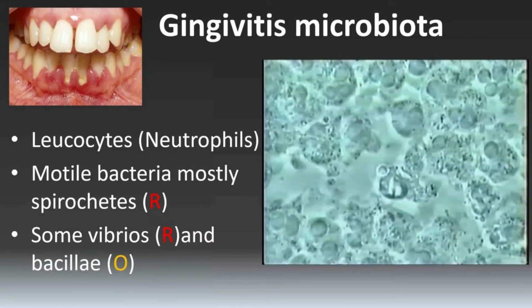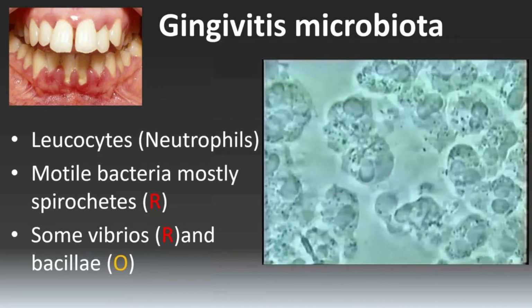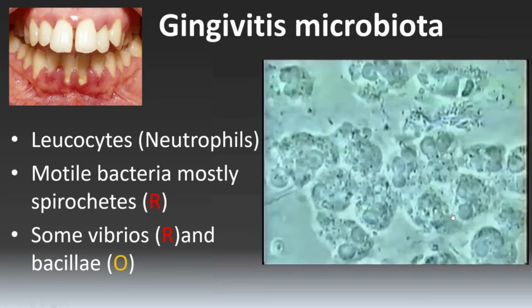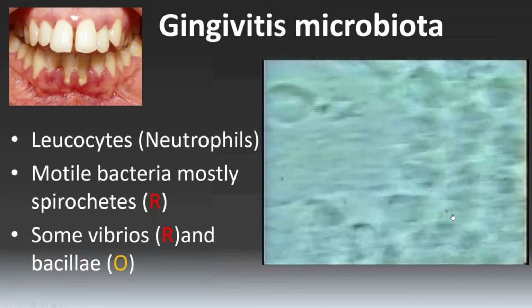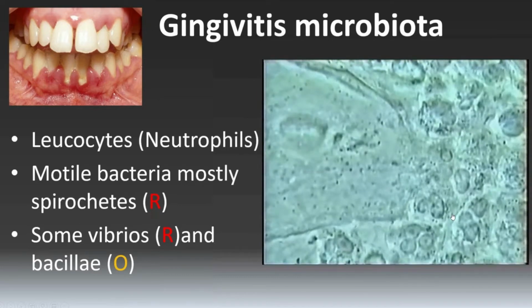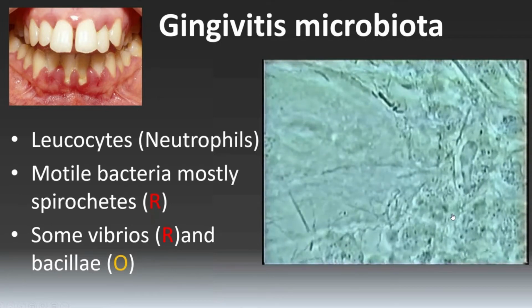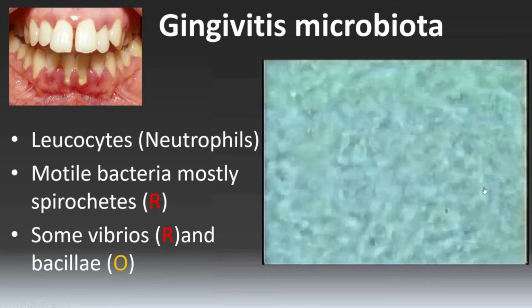So let's see again gingivitis. What is gingivitis? Here on the film with the patient, what do we see? This big gingivitis. See how big it is? You know, big gingiva, the gum line is like this. We look at the case, we think it's periodontal disease. It's not. There's no pocket higher than 4, no bone loss at all. It's just big gingivitis.